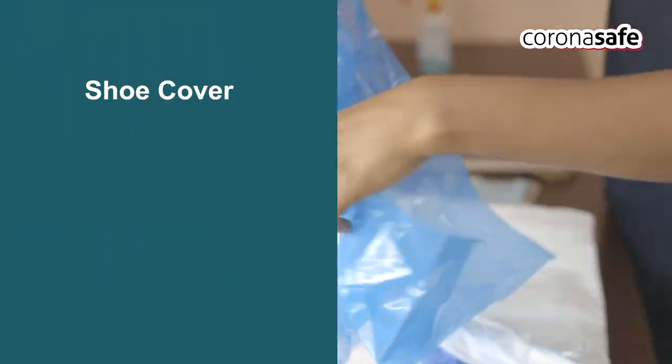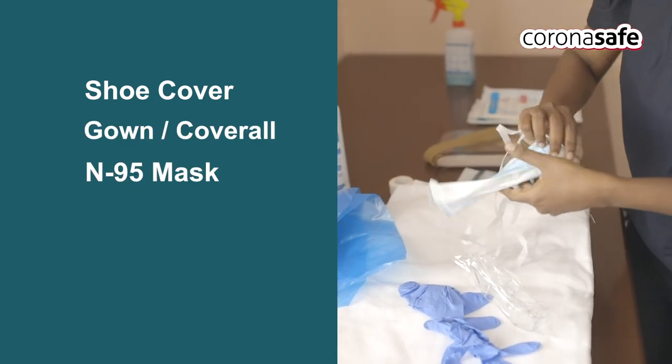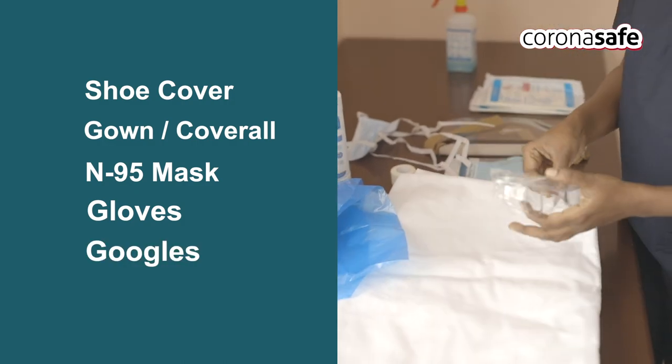The PPE kit components include: impermeable shoe covers — check for any damage; coverall; N95 triple layer mask; a pair of gloves; and goggles.